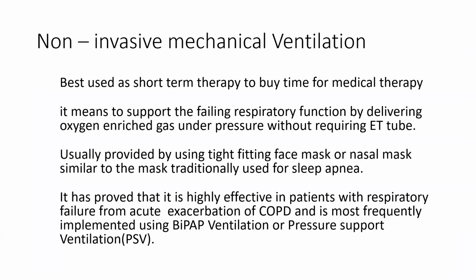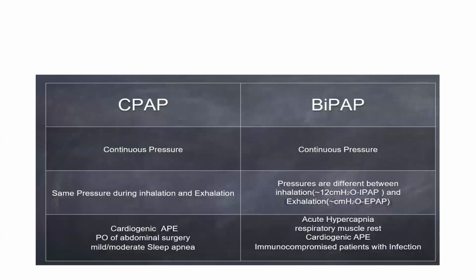Non-invasive ventilation is best used as short-term therapy to buy time for medical therapy. It means supporting the failing respiratory function by delivering oxygen-enriched gas under pressure without requiring an ETT. It is usually provided using a tight-fitting face mask or nasal mask, similar to the mask traditionally used for sleep apnea. It has proved highly effective in patients with respiratory failure from acute exacerbation of COPD and is most frequently implemented using BiPAP ventilation and pressure support ventilation.